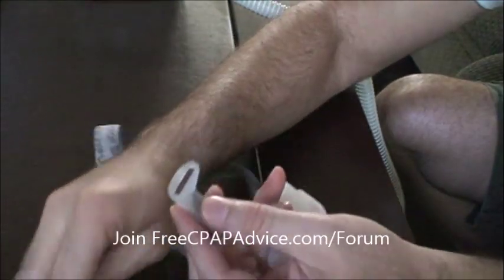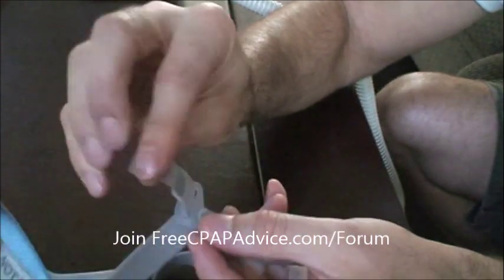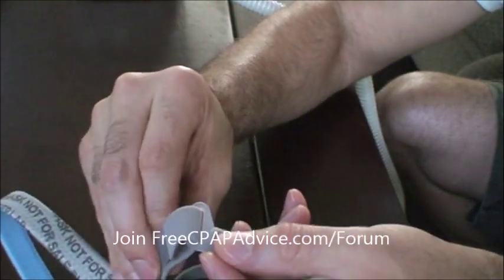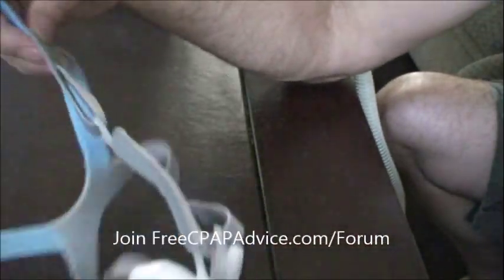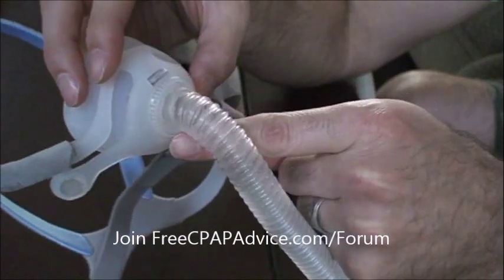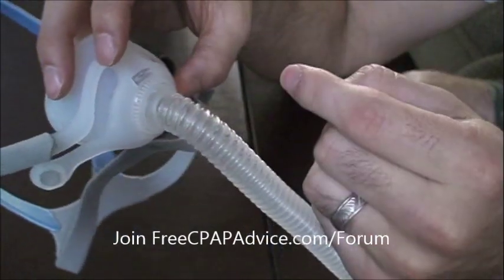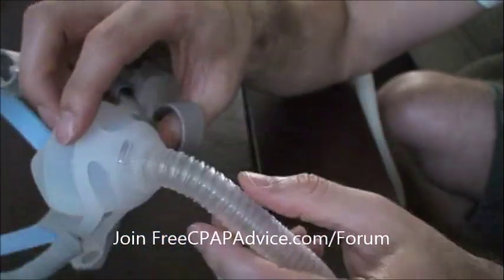My dad always has these big thick mask lines all the time — I keep telling him to wear the liners I got him. Anyway, this mask has a diffuser, and it's actually kind of loud. Some of their other masks are much more quiet, and actually a lot of other masks from other companies are a lot quieter.